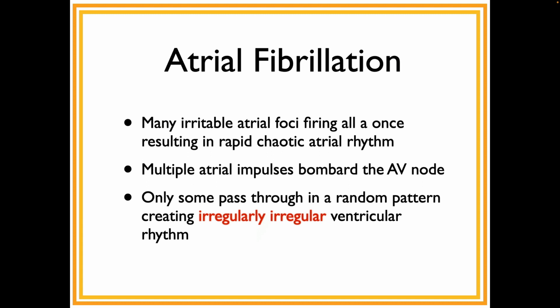You will hear people say accurately, when you're out in the field, and I'm just going to make up the numbers here so it's accurate but vague, that about 85 to 90% of the patients you put on a monitor will be in a sinus rhythm. And that's true. Despite the fact we're going to go through all these elaborate dysrhythmias for the whole term, most people you see will be in a sinus rhythm. Of the remaining 10 to 15%, again you will hear that about 85 to 90% of those not in a sinus rhythm are in atrial fibrillation. And that's also true.